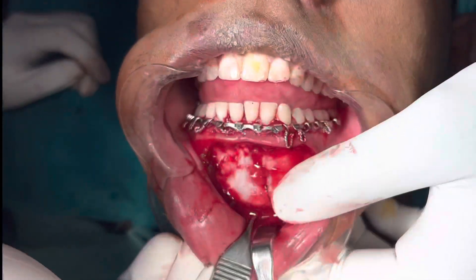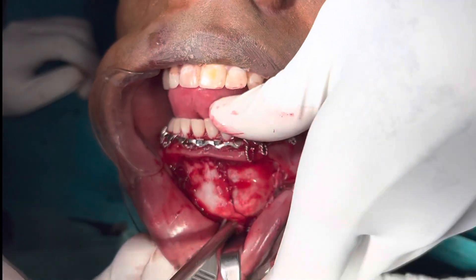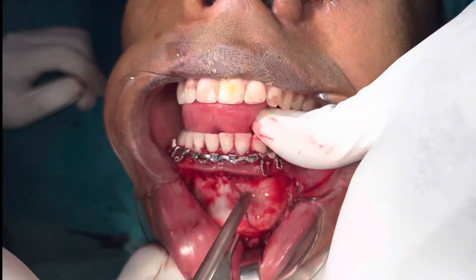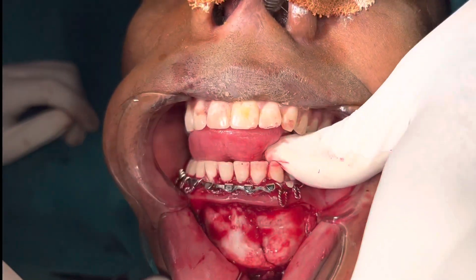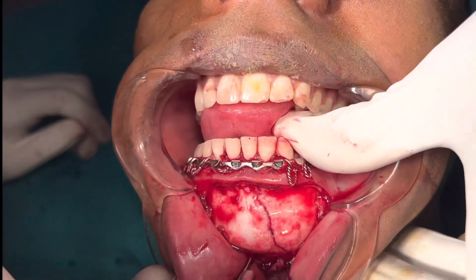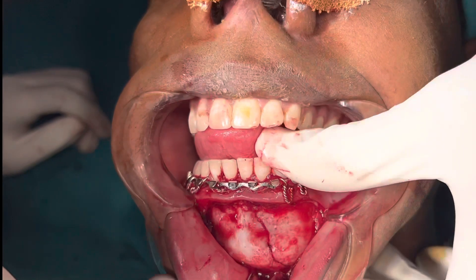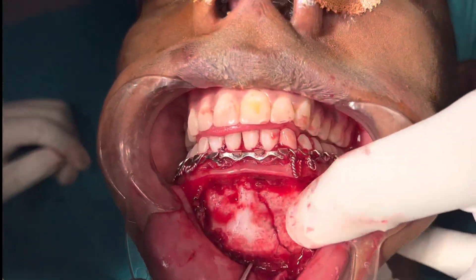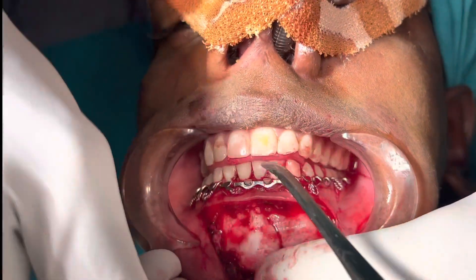We're going to reduce this and fix it. Reduction is by moving this part of the fragment outwards and moving this back. We've got good occlusion — once we get this, we'll use plates to fix it.